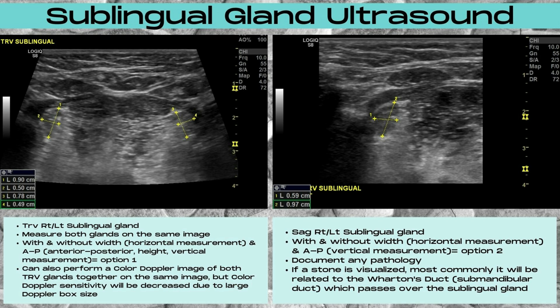You want to ensure you include a width measurement (horizontal) and an AP measurement (height or vertical), as well as a transverse color Doppler image. If a stone is visualized, most commonly it's going to be related to Wharton's duct — the submandibular duct — as it passes over the sublingual gland, although on ultrasound this may appear to be part of the sublingual gland itself.